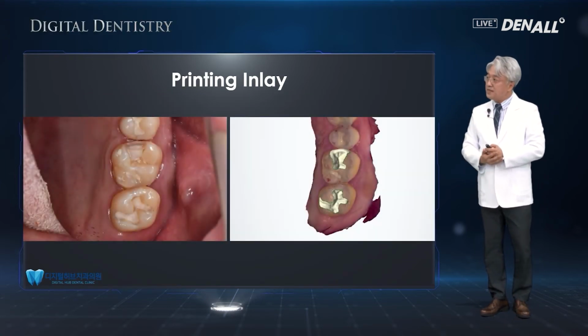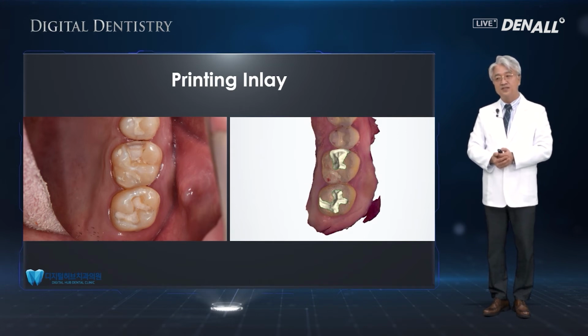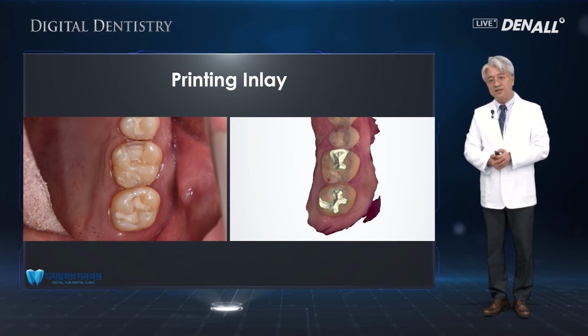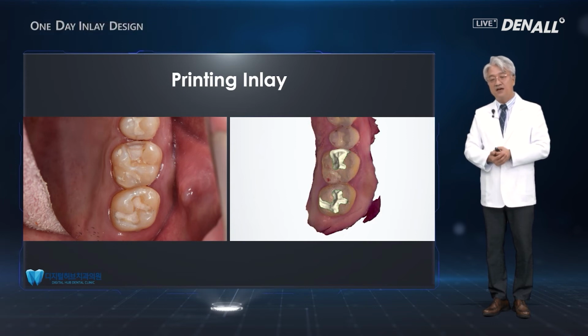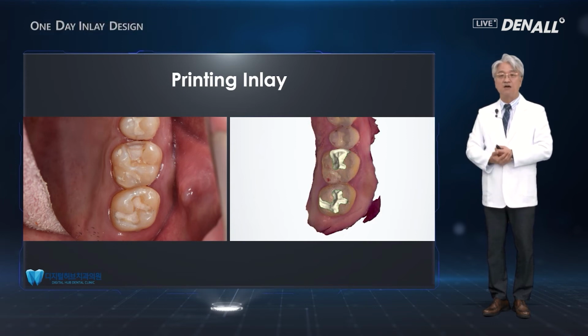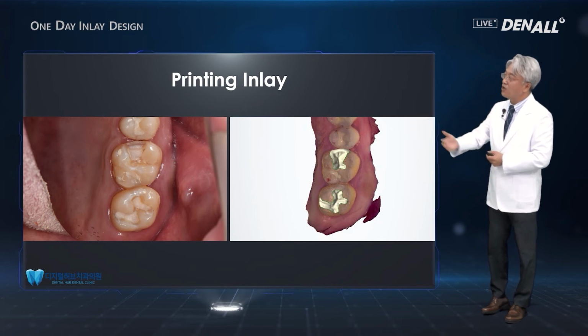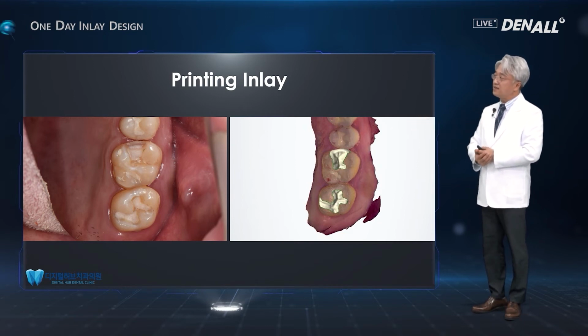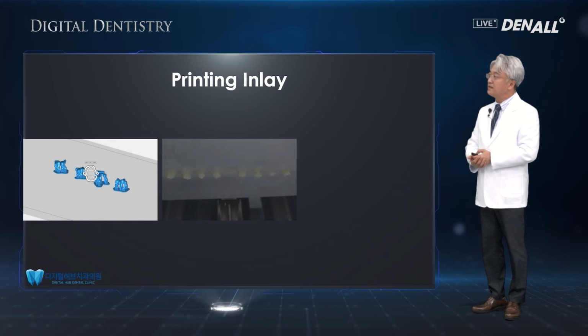Now, let's talk about printing inlay. The printing inlay, I think I'm using that a lot nowadays clinically, and the final materials are now available with resin and others. So as you can see in this case, MO cavity and O cavity, two printing inlays were prepped, and in the CAD software, the inlay was designed.